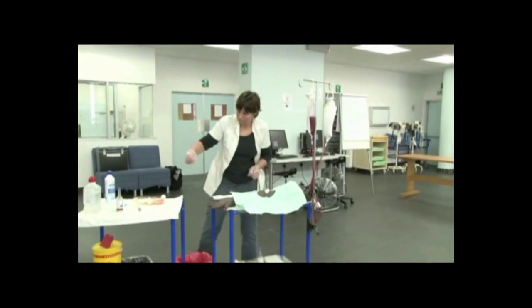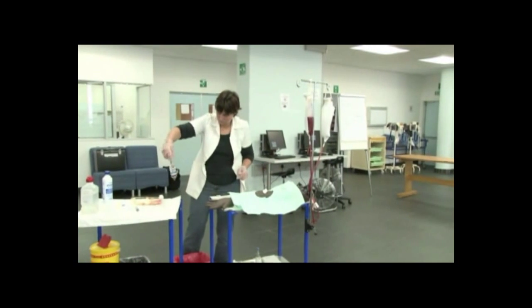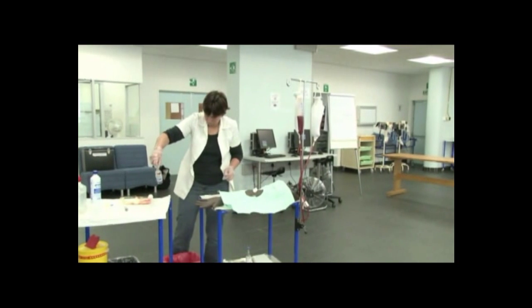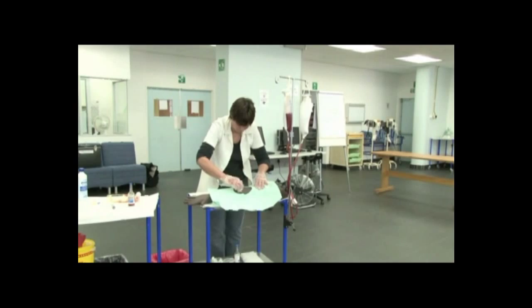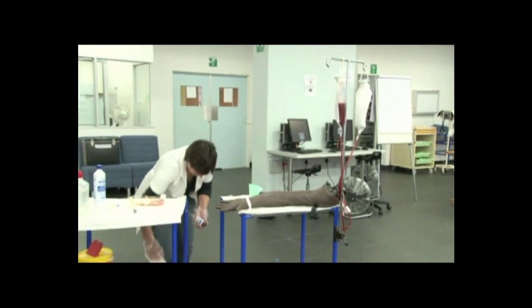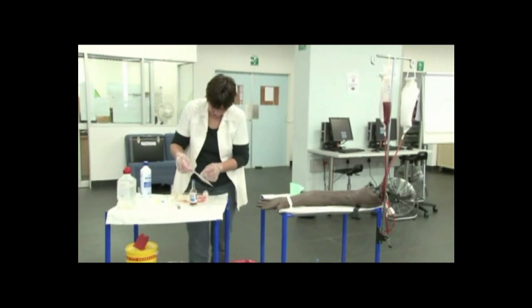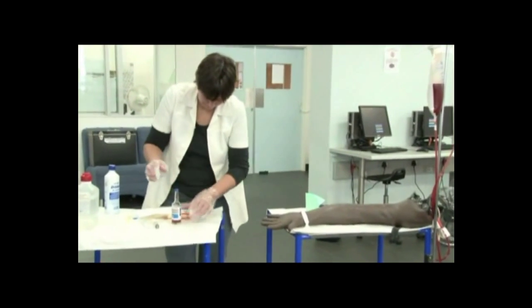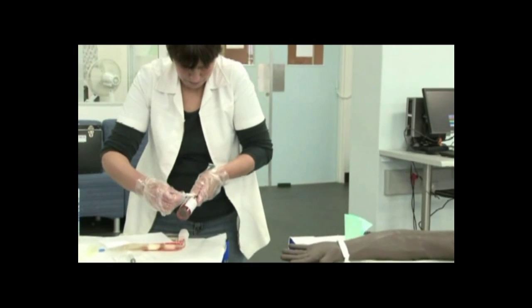Gently rotate the blood culture bottle to mix the blood and culture medium. Do not shake this vigorously. You will now label the blood culture bottle. Label the blood culture bottle, making sure not to remove the tear-off label on the bottle. Make sure that the patient labels do not cover the blood culture bottle barcode label and are not stuck across the bottom of the blood culture bottle.